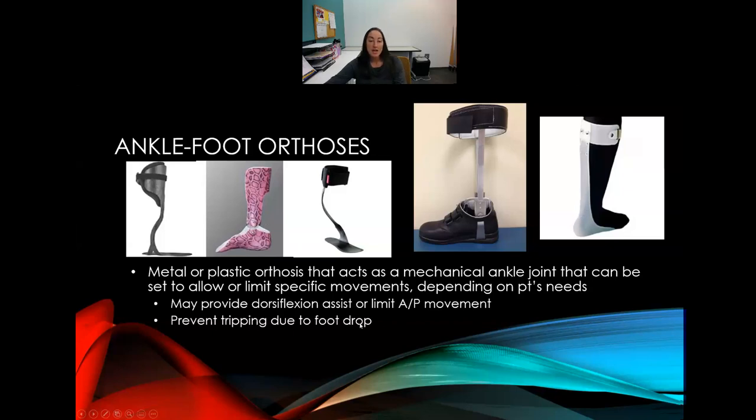It could also be a dorsiflexion assist, where it allows more dorsiflexion movement, or limits anterior and posterior movement altogether. It's often seen in patients who have foot drop, who have weak anterior tibialis and their foot is dragging, and this could help keep them from dragging their foot and tripping over their foot.